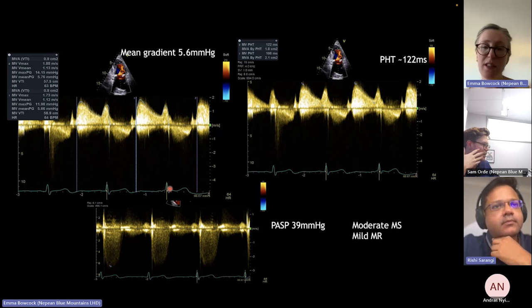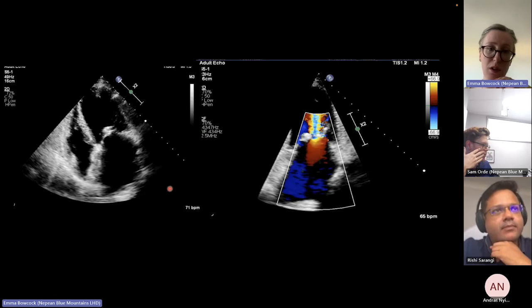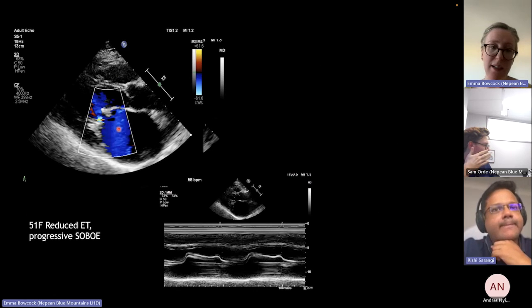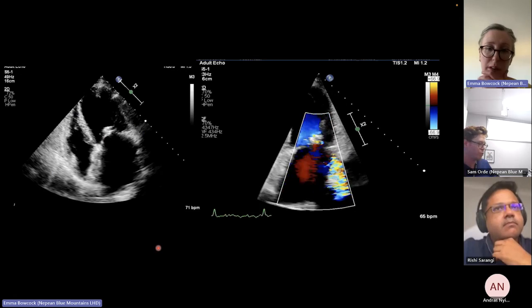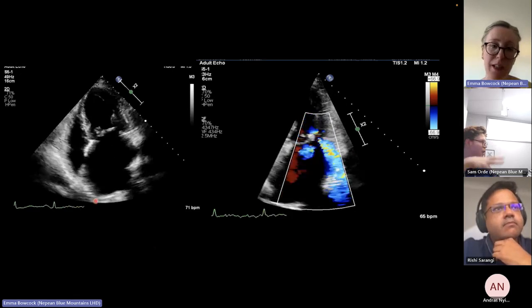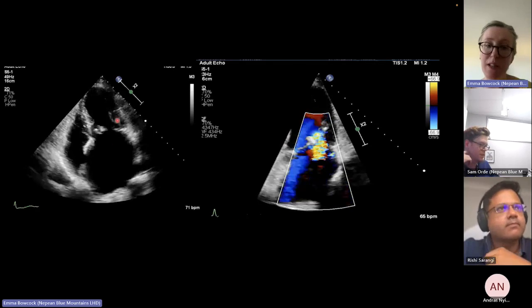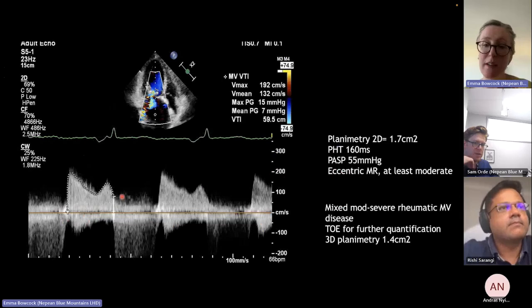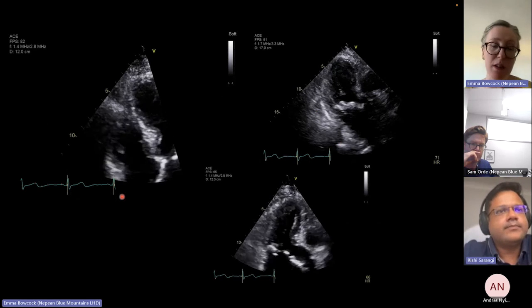And the first one was obviously rheumatic, and again, just highlighting for you all the differences there. So that classic doming, leaflet tips, reduced EF slope, all classic in your parasternal long axis and mitral M mode. And then again, no significant mitral annular calcification, as Michael was saying, but leaflet tips severely thickened. And yeah, so the differences there between the two.